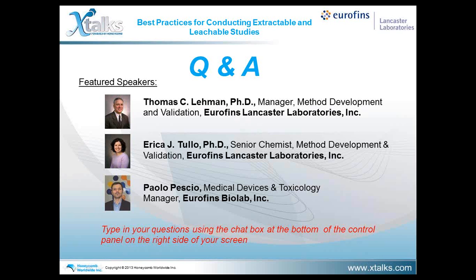That's a very interesting question, and my answer to that would be yes, but not necessarily easily. It really depends where the leachables migrated. If they're in the solution that the cells are stored in, you should easily be able to recover them from solution. If they've migrated through the cell and are in the interstitial fluid of the cell, again, you could disrupt the cells and collect that fluid and still monitor the amount of leachables present. My concern would be if they integrate themselves into the organelles within the cell, and then liberation of the leachables would be more analytically challenging, but I do believe it still could be accomplished. It may take a little bit of R&D to do so, though.